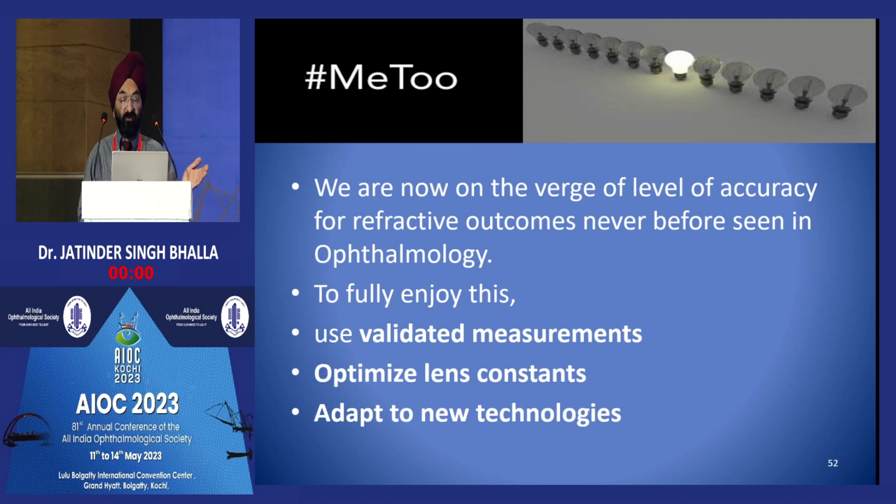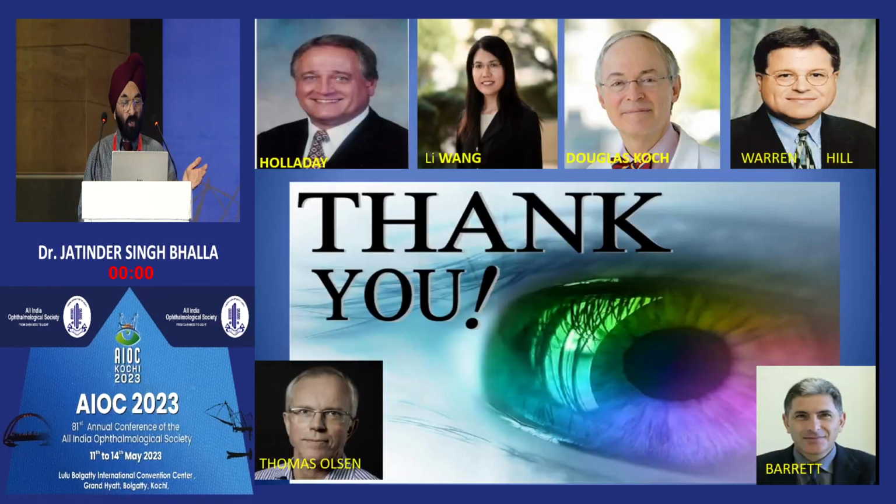And now we are on the verge of a level of accuracy for refractive outcomes never before seen in the field of ophthalmology. But to fully enjoy this, use validated measurements, optimize your lens constants, and adapt to newer technologies. And we are thankful to all these ladies and gentlemen for bringing us to this level of accuracy: Holladay, Wang, Koch, Warren Hill, Thomas Olsen, and Barrett.